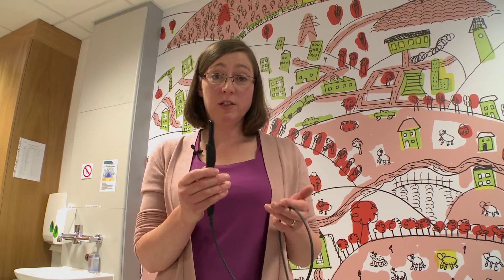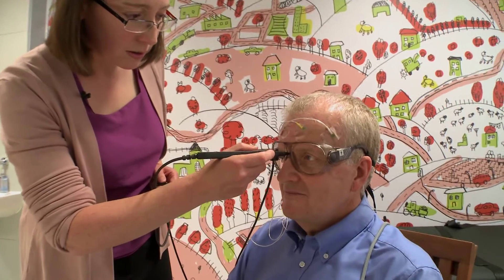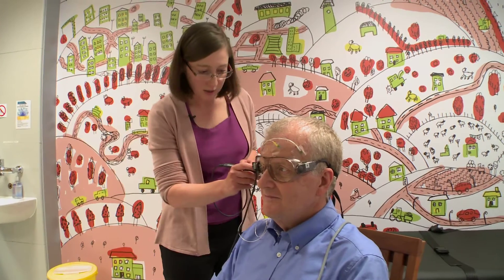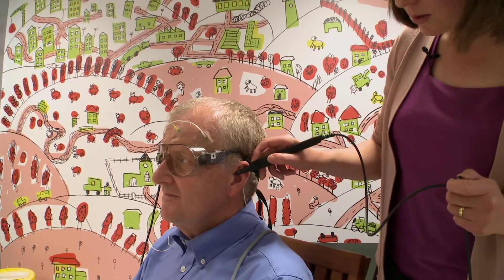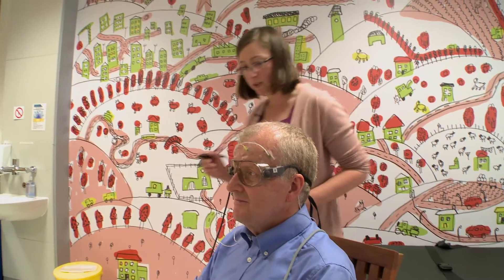First of all I'm going to measure the position of Stefano's nose — the bridge of his nose. The beep means that the computer is recording it. Then his ears — one, two. Now I'm going to do the same for all his coils.